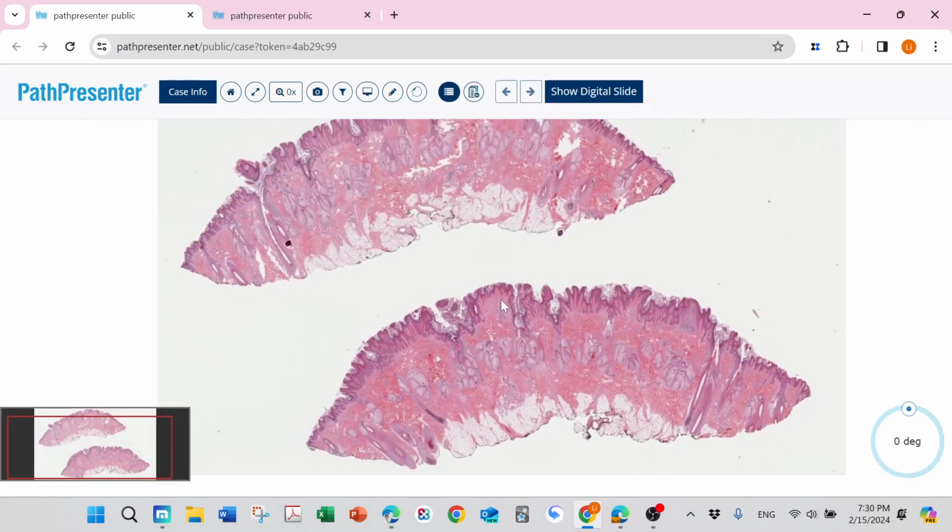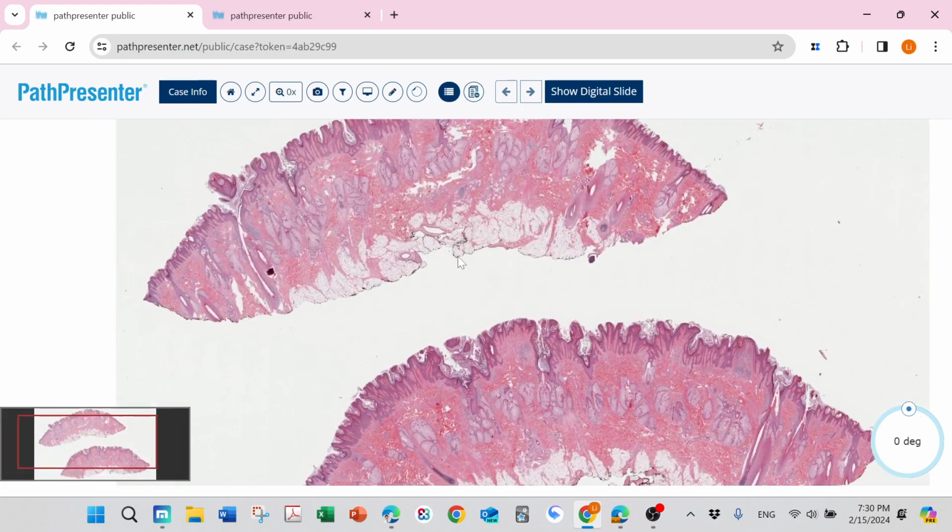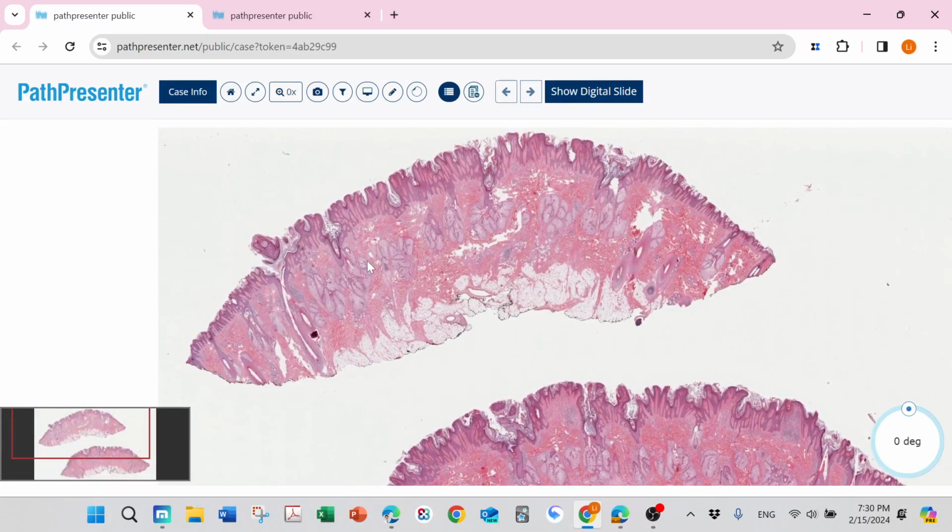So just a quick recap. When you see tons of sebaceous glands that do not open to hair follicles, just open to the surface of the epidermis, and around the sebaceous glands no hair follicles, but beside this hamartoma you can find normal hair follicles, that's really good for nevus sebaceus.